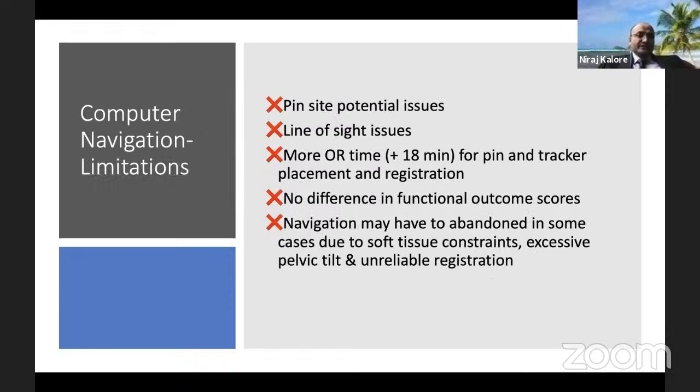The downside, there are multiple. Of course, the cost issue is there. Plus, you are putting pins in bone at different sites. It can cause some stress risers, and you can bone graft it, like Dr. Gopalan said the last time we talked about it. But that is an issue. You can also get infections. Also, the line of sight issue.